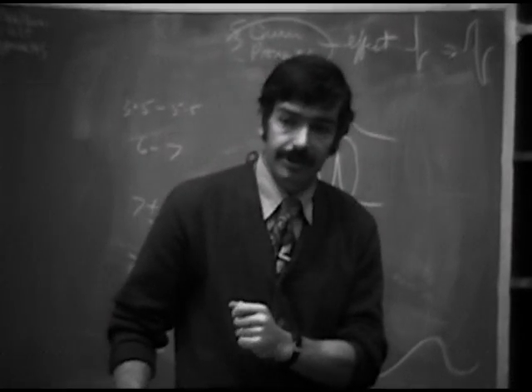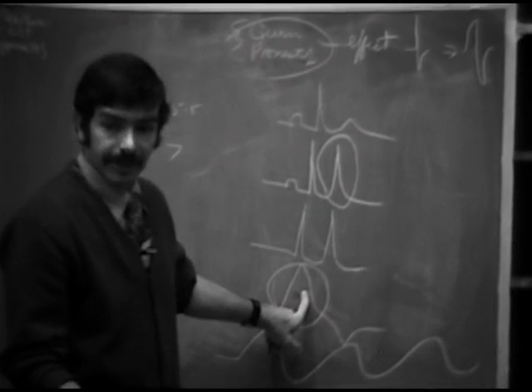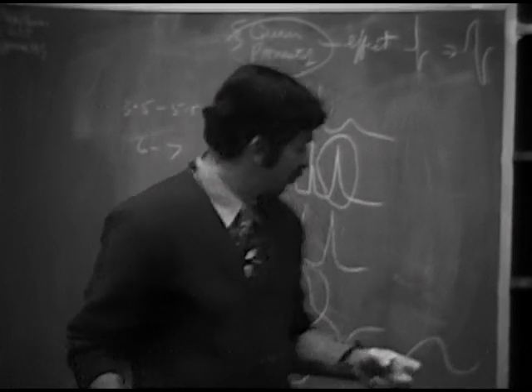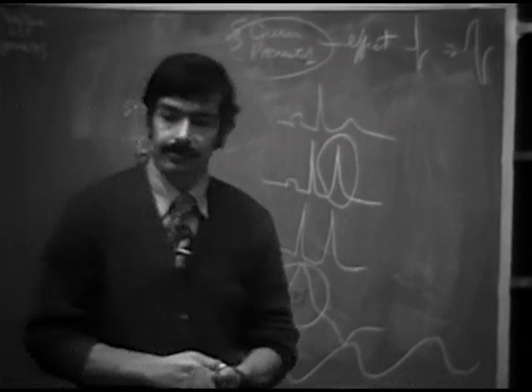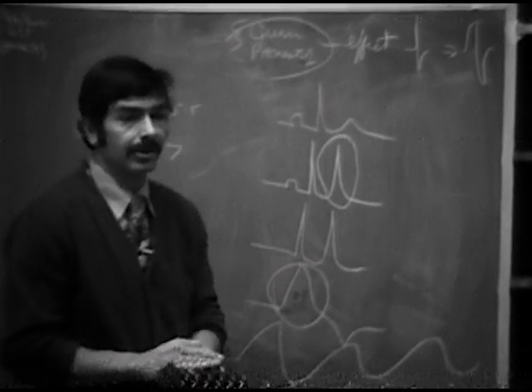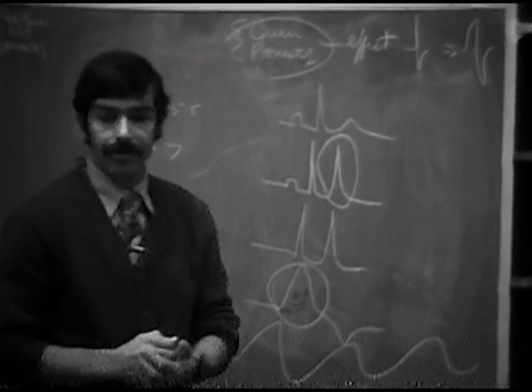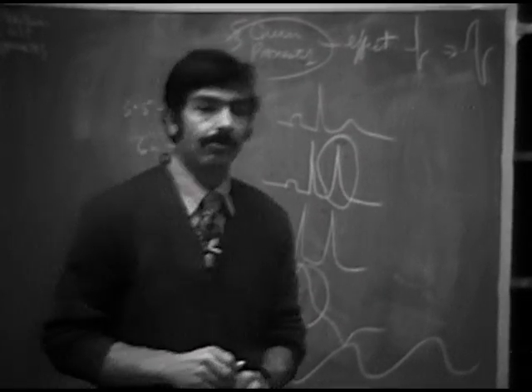In this type of situation, the rate is usually normal, whereas in complete heart block with idioventricular rhythm, the rate is usually fairly slow, in the 40, 50, or 30 range. Whereas here, it looks like complete heart block with idioventricular rhythm, except the rate is surprisingly normal. It may be slow, around 60, but it's generally faster than the complete heart block range. So that may be a tip-off. But the important thing to remember is that these patients present clinically in 2 ways: one is T-wave peaking, and the other is intraventricular block, or the wide QRS complex.